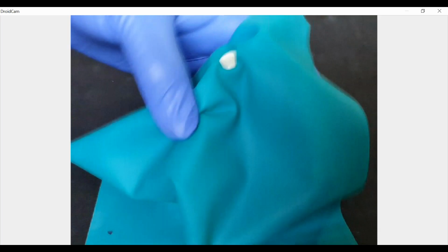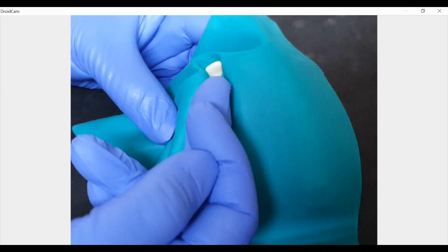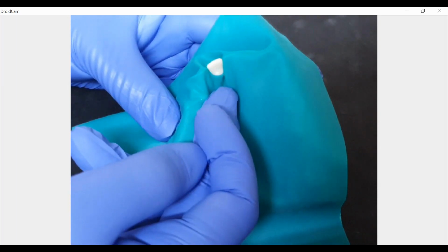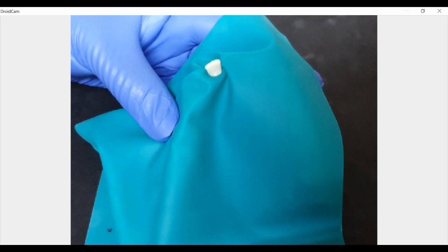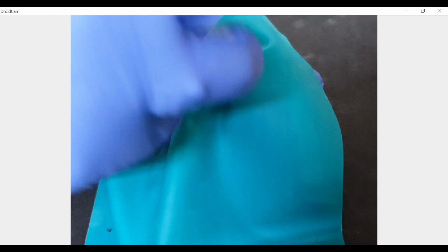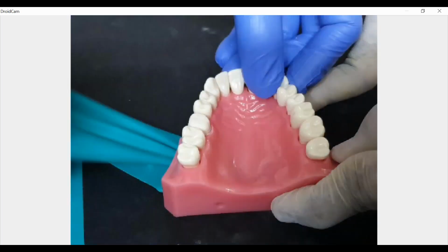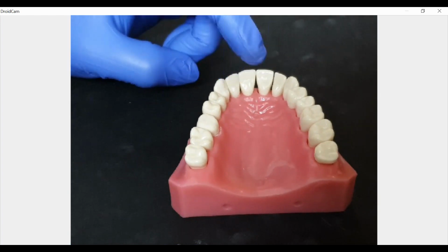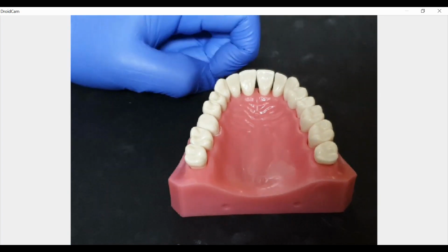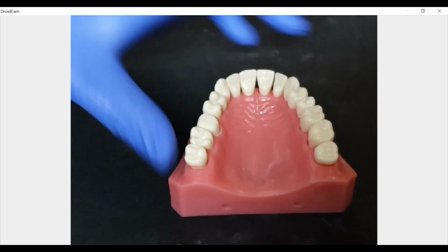In a double bow isolation, the bows on either side will interfere with the access to the lingual surface, the palatal surface of the anteriors. So if you want to perform root canal treatment on, say, the lateral, if you isolate with a double bow, you'll have limited retraction of tissues and limited area to work with. So instead, why not isolate 2 or 3 teeth? If you want to isolate for the lateral, you can isolate 1 or 2 teeth on either side, and that will complete your isolation. So let us see how to perform isolation from 3 to 3 on an upper model.